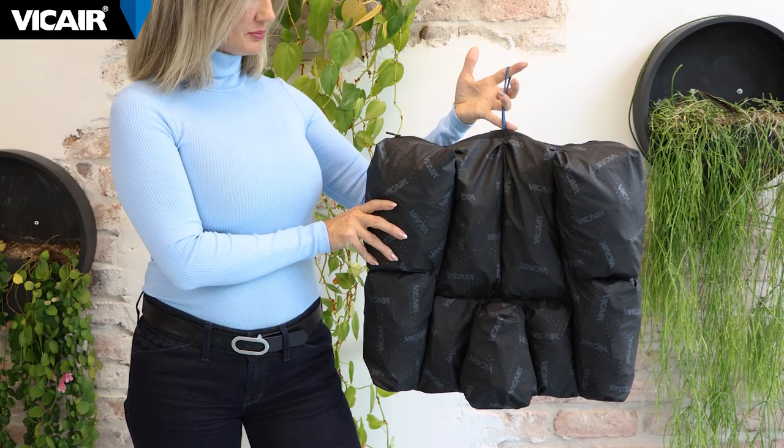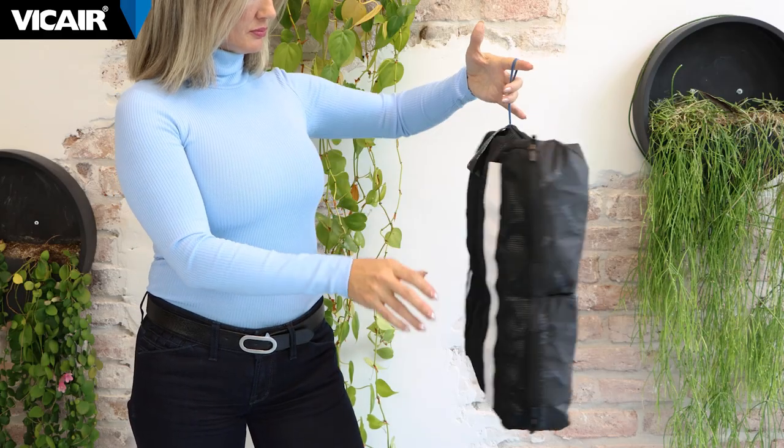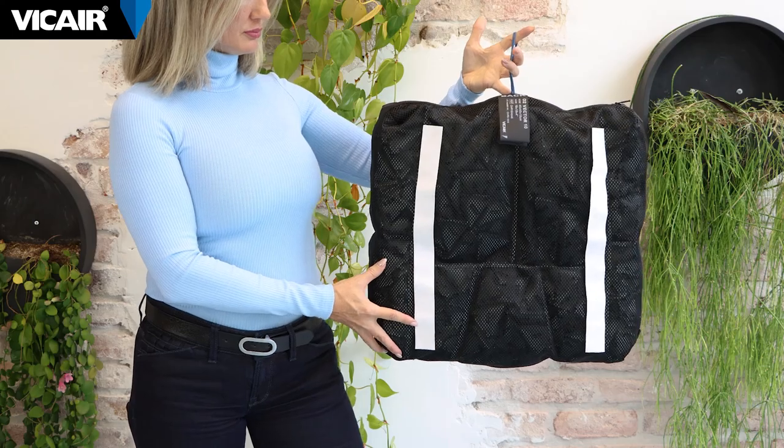The top side of the cushion is made of a perforated material and the bottom is made of mesh. This contributes to the excellent microclimate properties of the cushion.